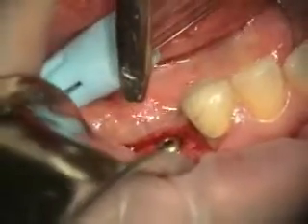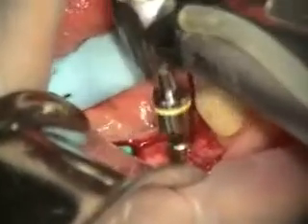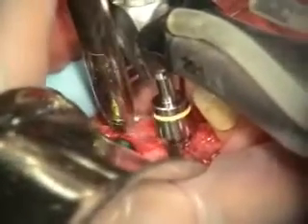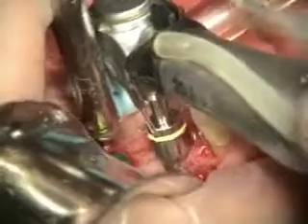This is a BioHorizons bone profiling setup — it has some sleeves and then it has the bone profiler that goes over the sleeve. If we had soft tissue, we would be going in reverse first and then going forward, but since we don't have the soft tissue there, we just go forward and profile the bone.